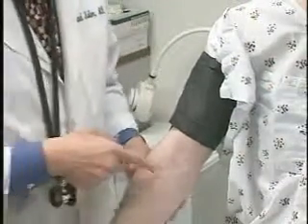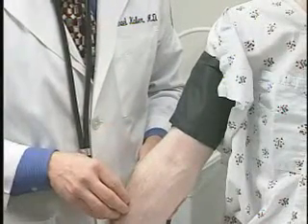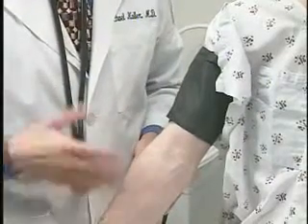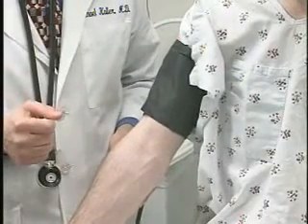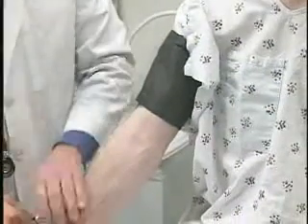Again, the blood pressure must be taken on skin. It shouldn't be taken over an article of clothing or the patient's gown. The patient should be relaxed and calm. Don't check the blood pressure if the patient just rushed into your office, they're late, or if they're crying, because of course the blood pressure will be elevated. First, we're going to check the blood pressure by palpation.